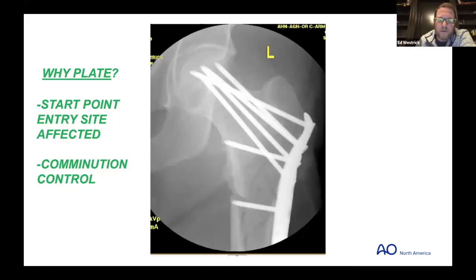Yeah, so this is mixing modes. Things you're not supposed to do, but in a situation like this, I kind of broke the rules a little bit. But again, even with an incision and all of these fragments, you're respecting all these soft tissues.